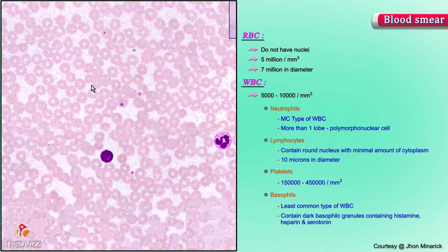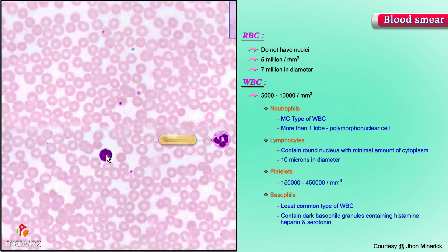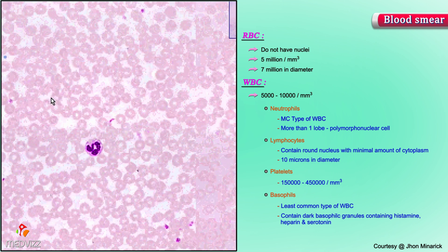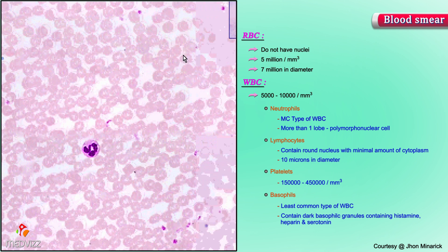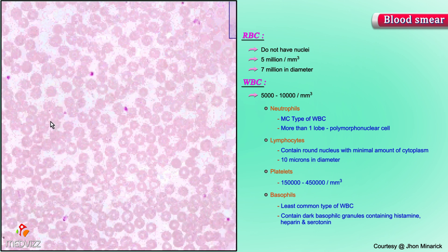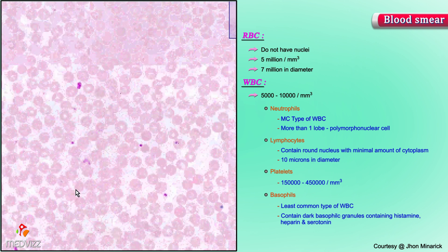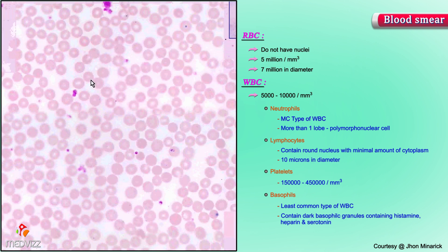Here is another neutrophil. Here's another lymphocyte. All the rest of these are red cells. All these little pink dots are platelets. Here's a platelet. Here's a platelet. The rest of these are strictly red cells in this area.